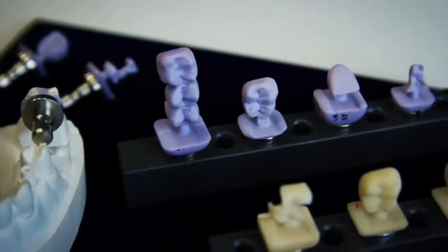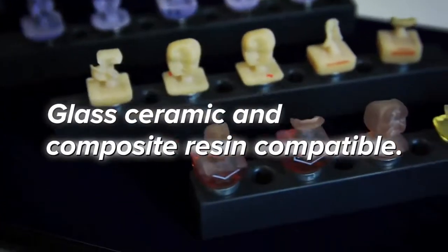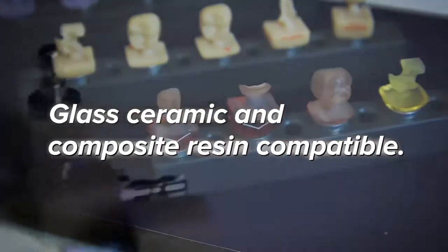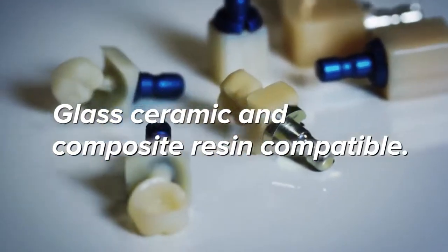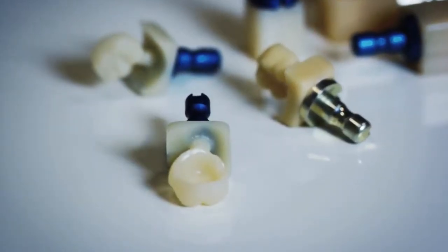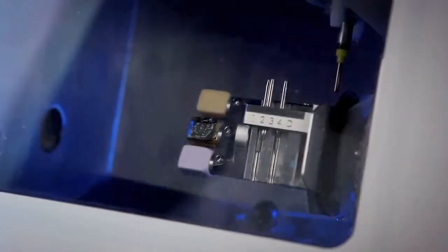Designed to wet mill precision dental restorations from glass ceramics, as well as popular composite resins, the DWX-4W provides your lab with the solution it needs to meet your growing demands.